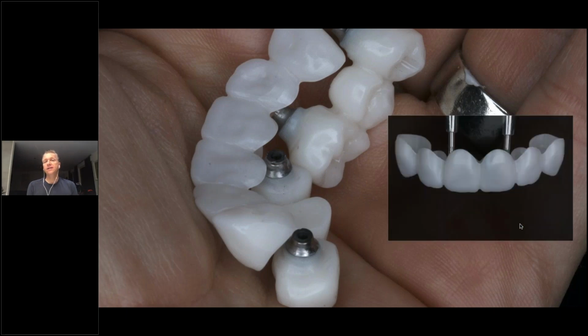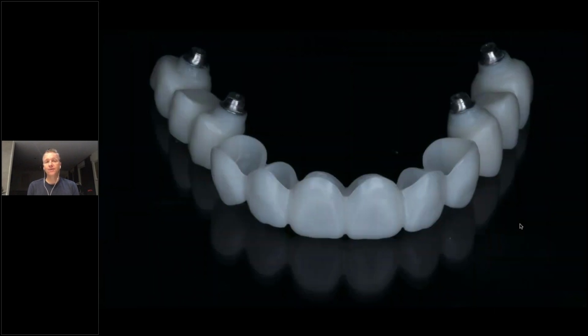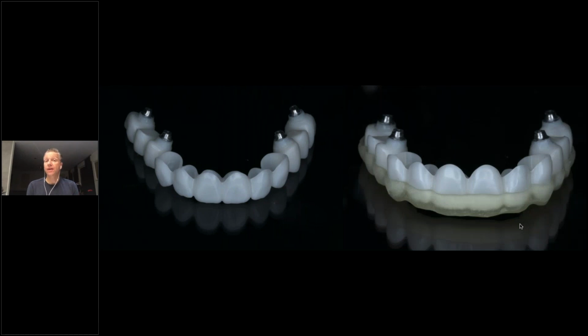Now I see here the anterior shells. I see in my hand the 2 screw-retained implant bridges, also with the A-temp created in a very light shade. Of course, it's Miami, right? Here everything is aligned, and then I can put everything in that seating stent. That definitely helps me a lot to keep control.